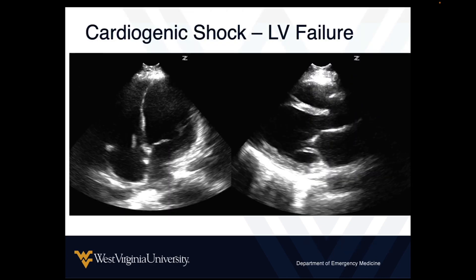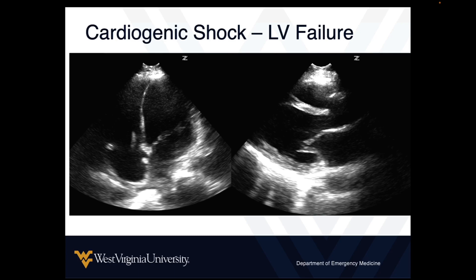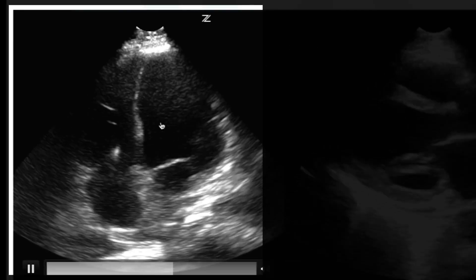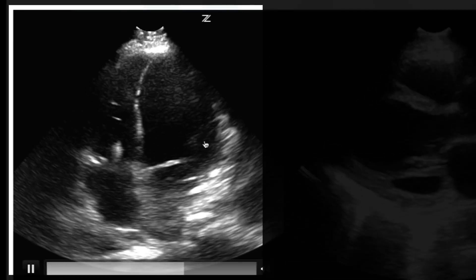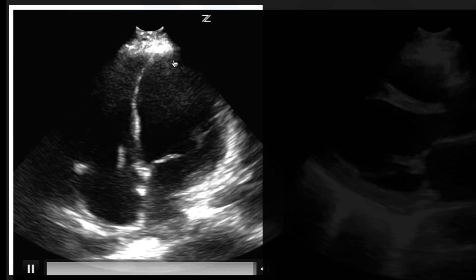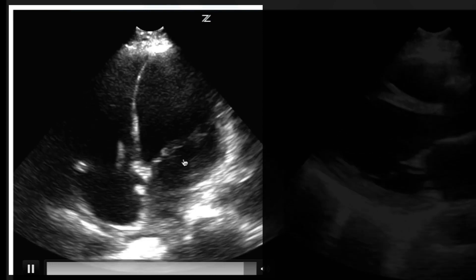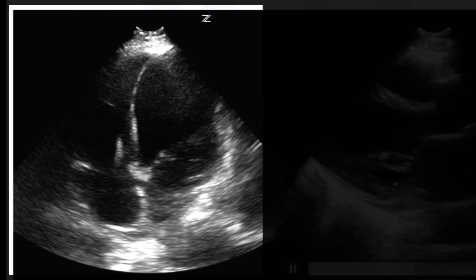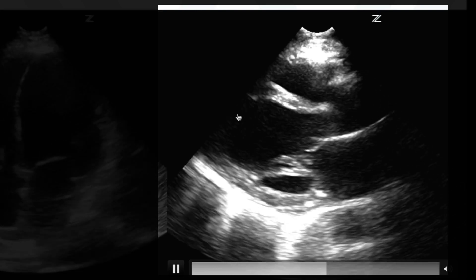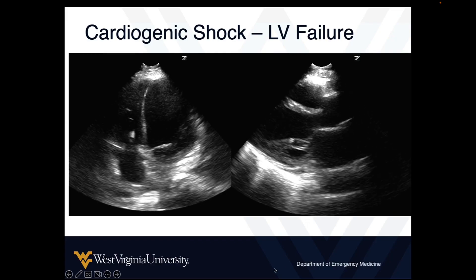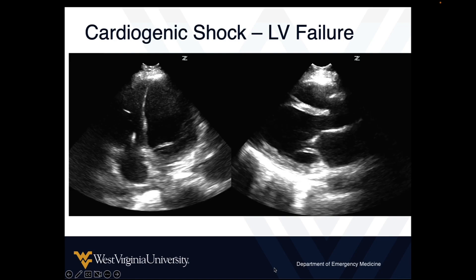Just a few more examples of classic pump failure cardiogenic shock. We see dilated left ventricles, not a lot of change in shape during systole. We see poor opening of the mitral valve, also demonstrated here very well — not a lot of change in shape. So these are pretty obvious signs of left ventricular failure.